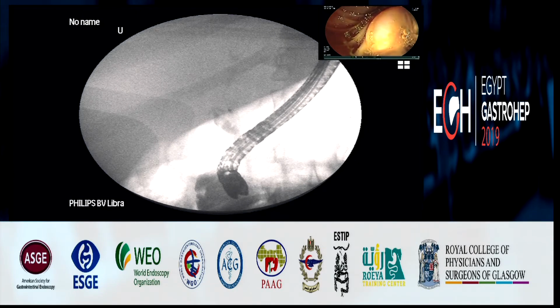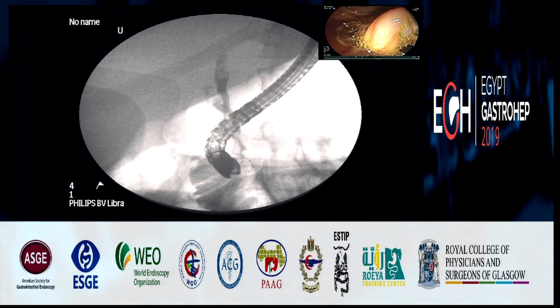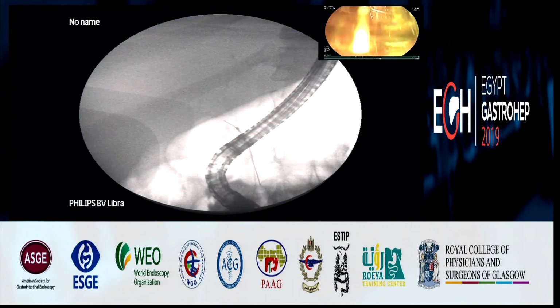So you're going to do some sort of occlusion cholangiography? That's your plan? Here we'll see if there's still a stricture. We have to define the anatomy better. That's why the extraction balloon will help us to have a good cholangiogram, and then we will see if there's any residual stricture and how it looks.